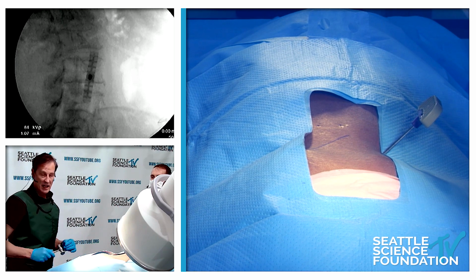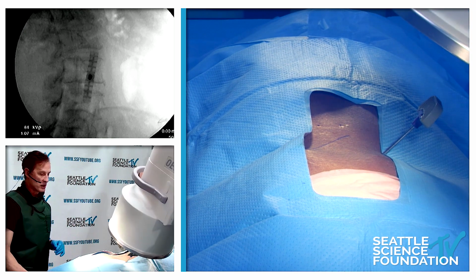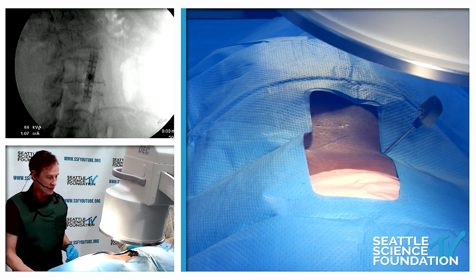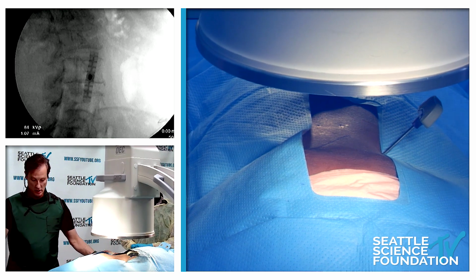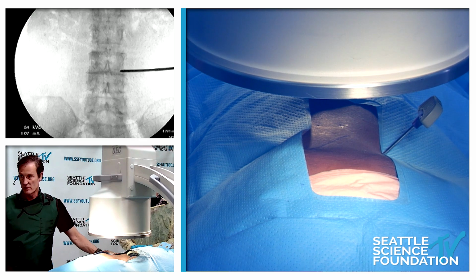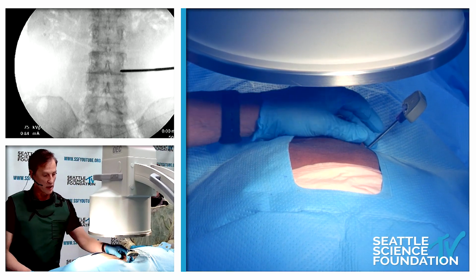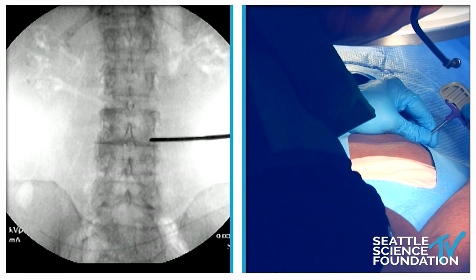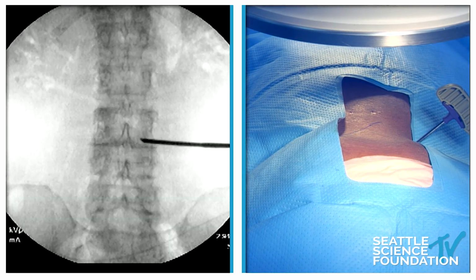All right, we'll come back. Let's do an AP view from that. And this is a different view, and if you're not used to seeing this, it can throw you off a little bit. This is very useful for severe vertebral plana. It's very useful for getting around hardware, and this is exactly where we want to be. So I'm going to drive it in just a little bit on the AP, and then we'll go lateral after that. All right, good show.